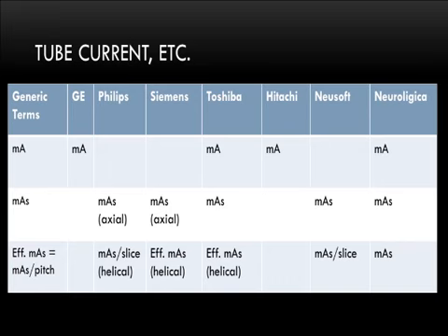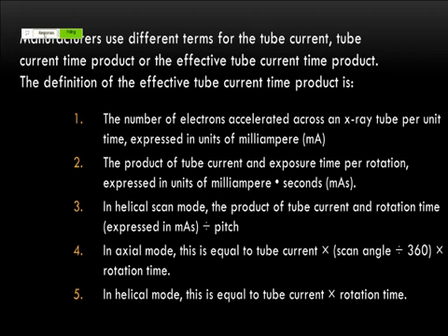Okay, next, Sam's question. We ready? Good. The manufacturers use different terms for the tube current time product, or the effective tube current time product.